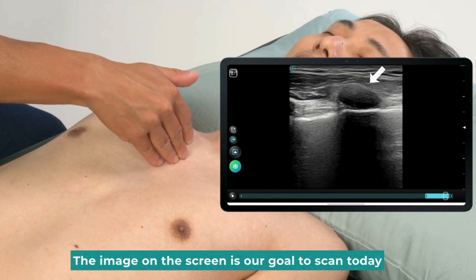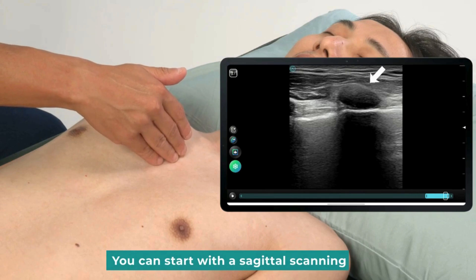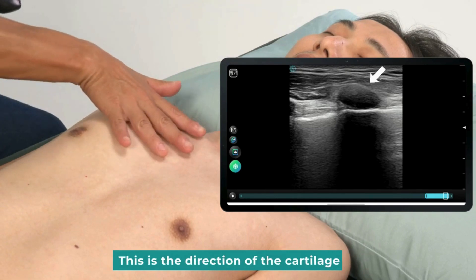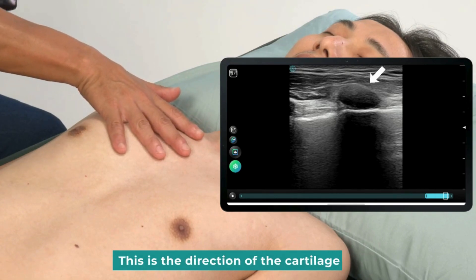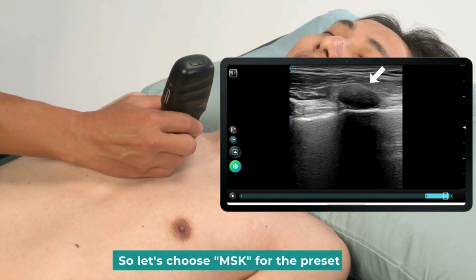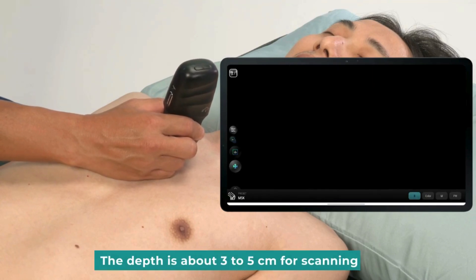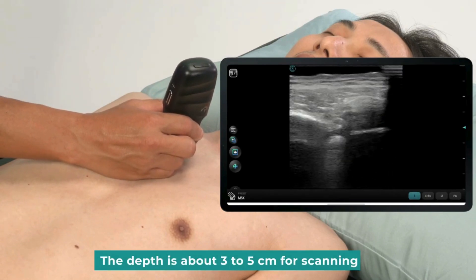The image on the screen is our goal to scan today. If you want to scan the cartilage, you can start with a sagittal scanning — this is the direction of the cartilage. We will place the probe in the middle, since this part is superficial. Let's choose MSK for the preset. The depth is about 3 to 5 centimeters for scanning.